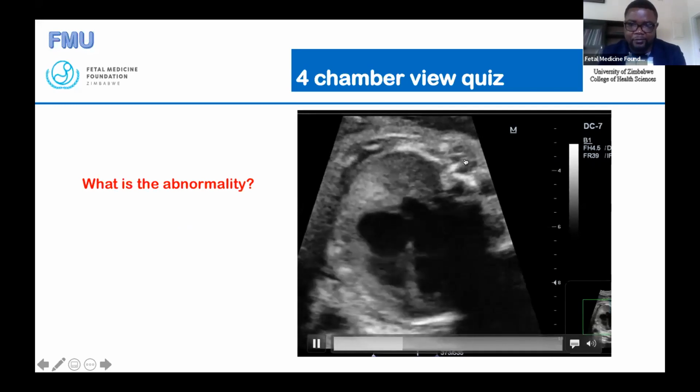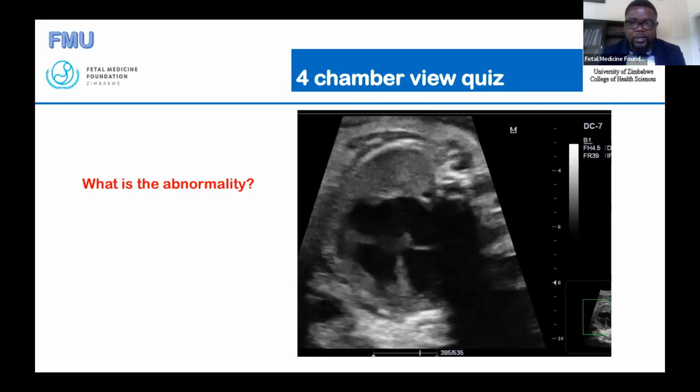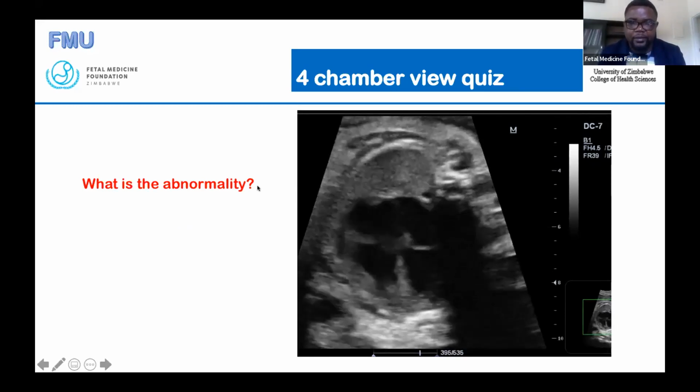This is a live video we took on one of our babies we were scanning, and I've just thrown it there. And I'm saying, what do you think is abnormal about that baby? It's a heart.